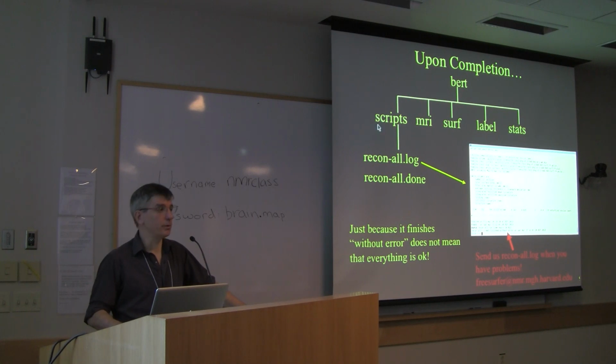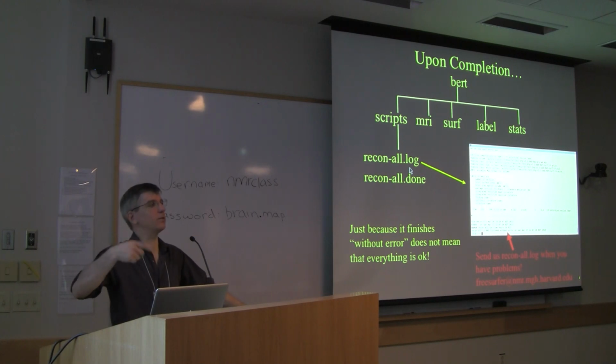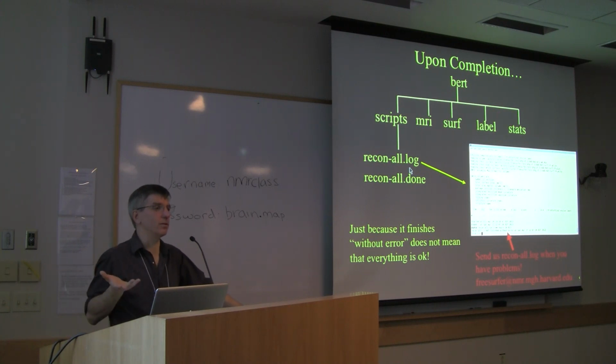Under the scripts folder, you'll see something called recon-all.log, and that's going to have all of the terminal output. When you run recon-all, it's going to start spitting stuff to the terminal, and when it finishes in 10 hours, it's going to have a huge amount that it sends to the terminal. That information is potentially useful in trying to debug what's going on, or to see exactly what happened during an analysis.